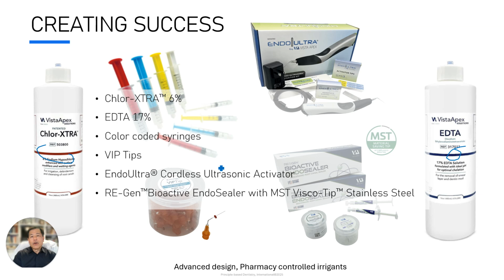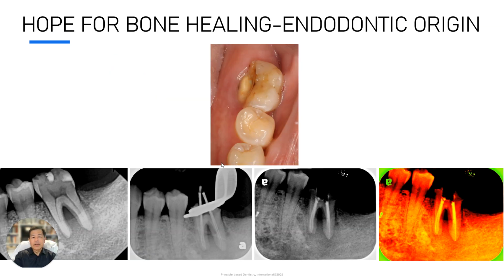I don't want to have a puff, but I try to minimize the puff that we get at the very end. So I'll just gently place the sealer, withdraw the tip so I'm not expressing it out the apical end, and then I gently place the gutta percha so that, again, we try to minimize what we express out the end of our shaped canals.